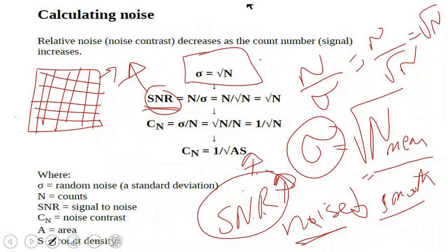For example, if you look at MR images, you will find that in MRI, the SNR is provided along with the acquisition parameters, telling you, for instance, that you want an SNR of 1 or SNR of 1.5. If this SNR is high above a certain level, you will find that the image becomes very smooth and the details start to disappear, resulting in a very smooth image with reduced resolution.